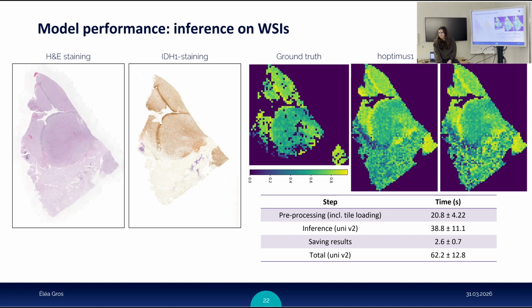Yeah. But the aim is always to get the most hypercellular area where you have most tumor cells. And for that, sure, the size is important. If the patch is really minimal and you're next to a low-level infiltration area and you make a patch from it, it's not going to help the molecular analysis at the end.